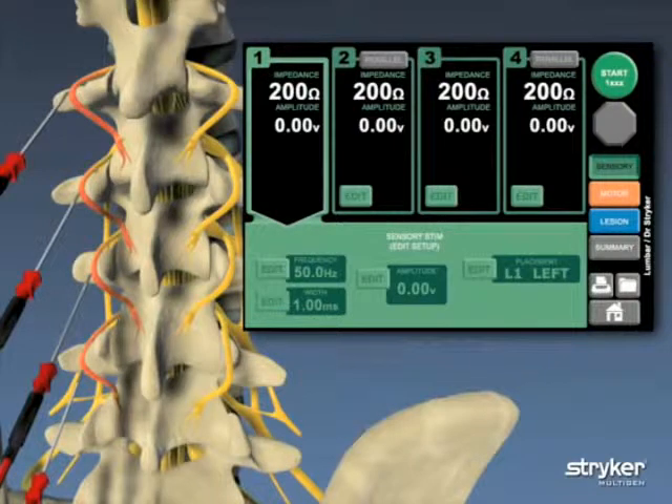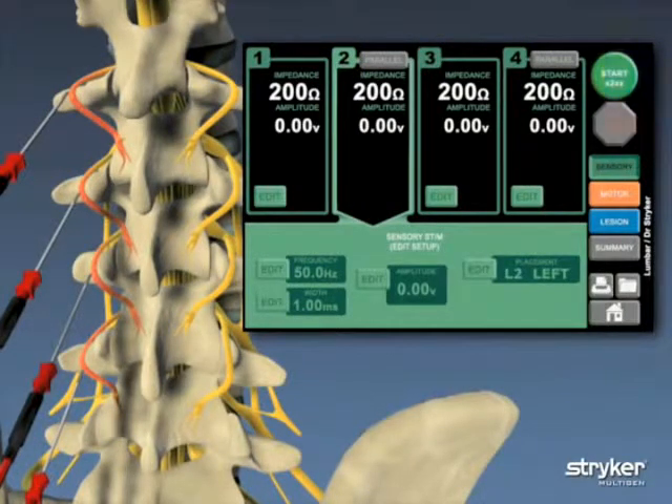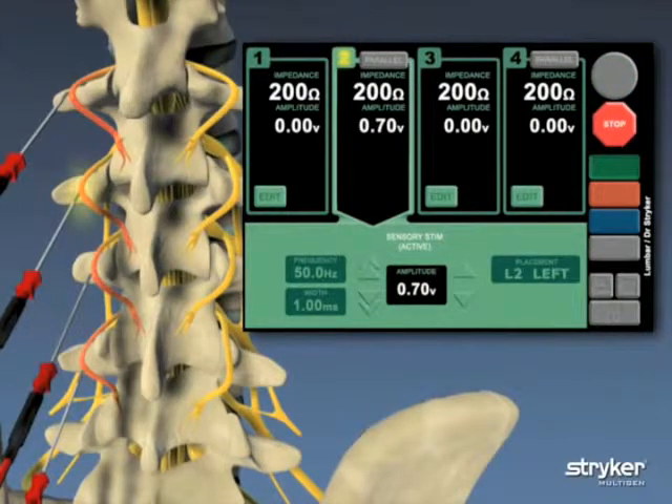During the sensory test, the patient will respond to a slight pain sensation the closer the needles are to the problem nerves. Needles may need to be repositioned if these tests fail.